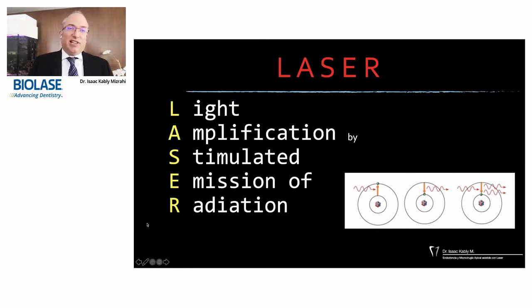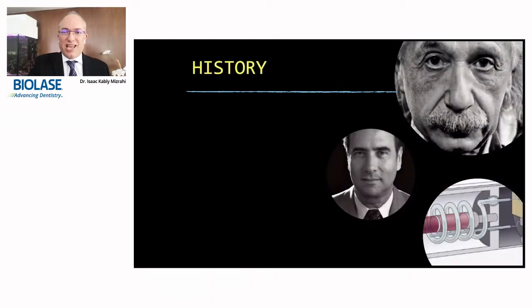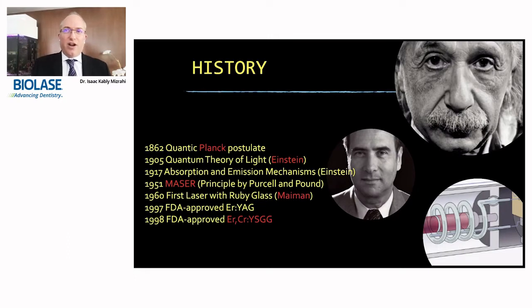First of all, laser is an acronym of light amplification by stimulated emission of radiation. And with this little Bohr model, where the electron jumps from one level to the other, one photon becomes two photons. I'm not going to get into physics, but it's very important for us to understand that laser is an acronym of light amplification by stimulated emission of radiation. These two guys in history have a very specific role.